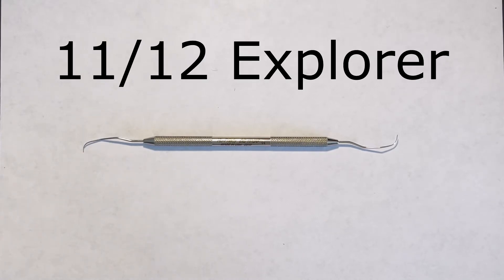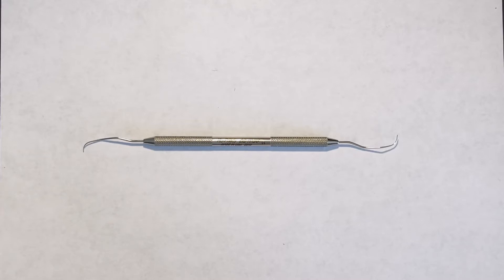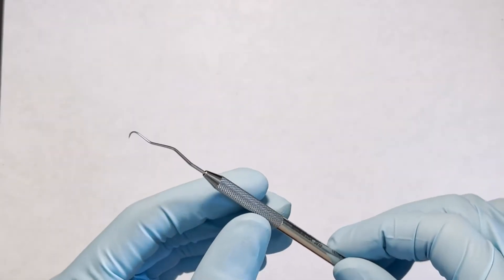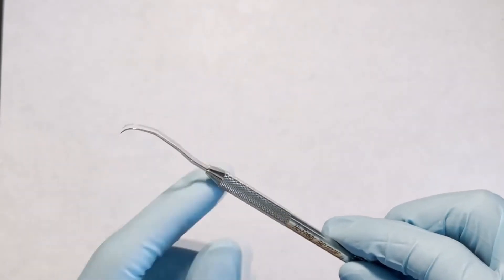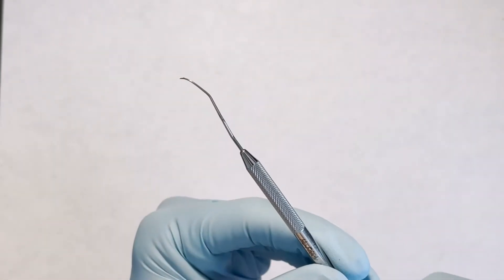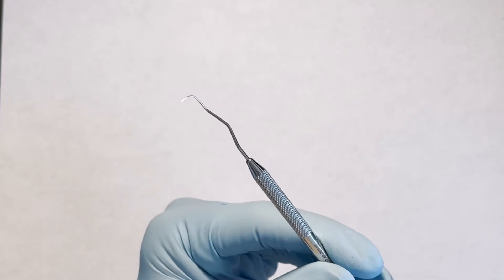This is the 1112 Explorer, used for diagnosing calculus and caries and for exploring subgingival root surfaces, restorations, and furcations. It is made of a flexible metal that conducts vibrations from the working end to the clinician's fingers. The 1112 Explorer features an angled functional shank which allows it to better adapt around interproximal root surfaces.